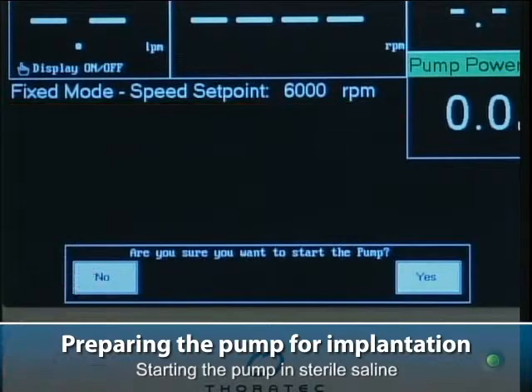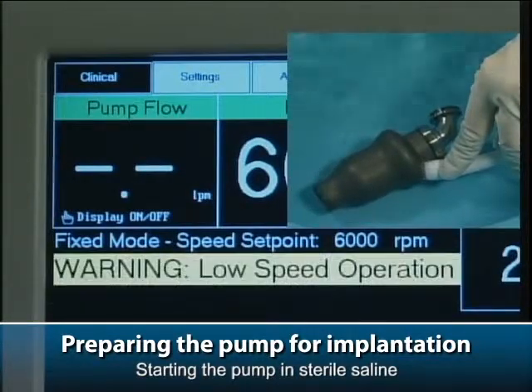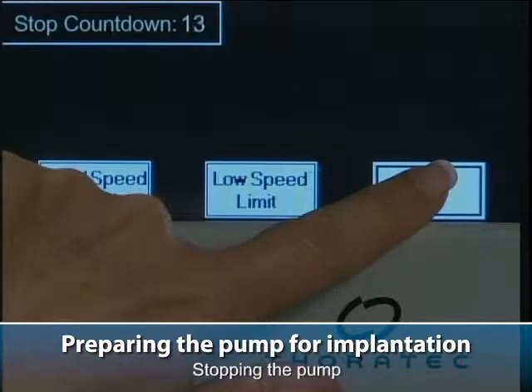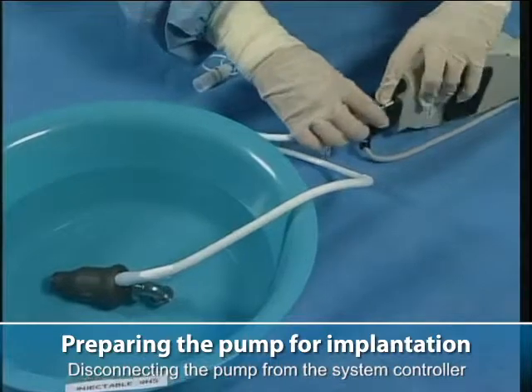Starting the pump in sterile saline. Disconnecting the pump from the system controller.